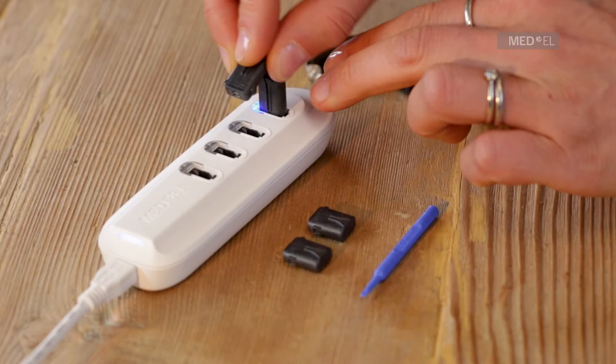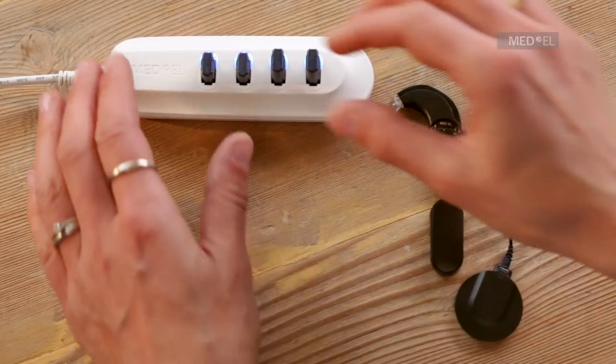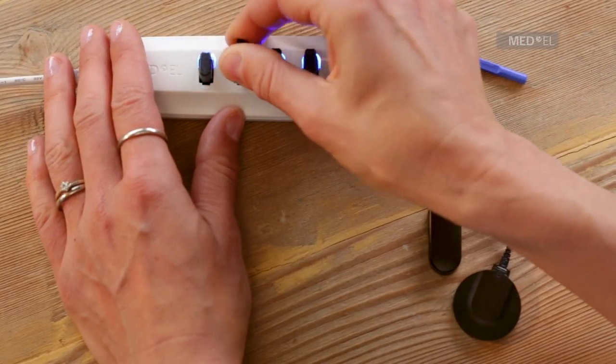When the indicator light turns off, the battery is fully charged. This takes up to four hours. Gently remove the charged battery from the charger.